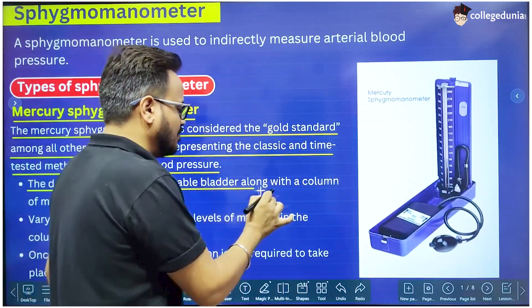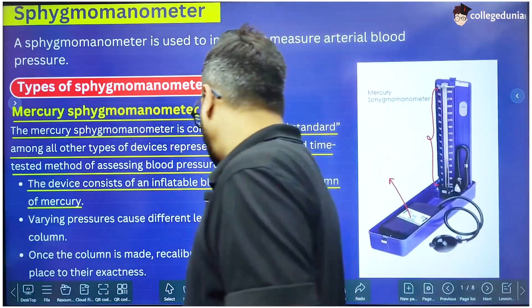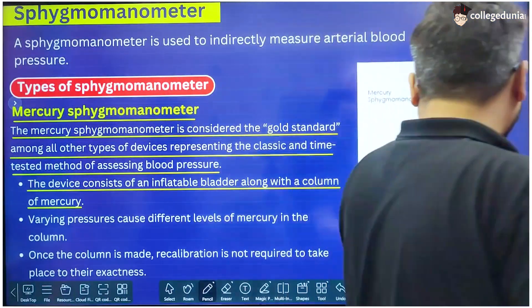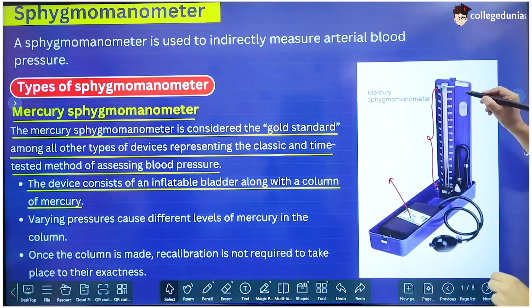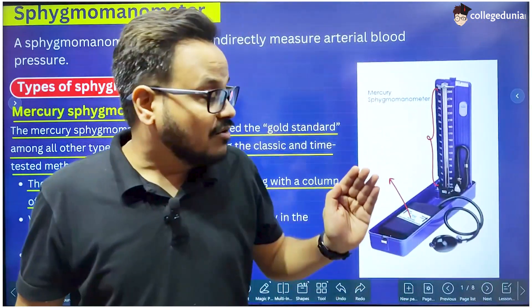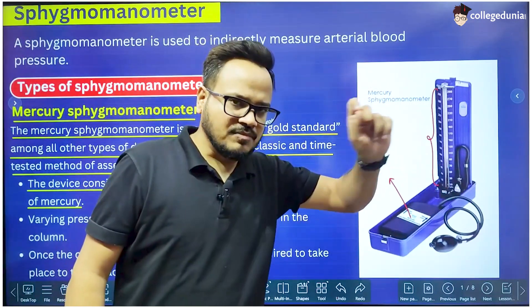The device consists of an inflatable bladder along with a column of mercury. This is the inflatable bladder and this is the column of mercury. The varying pressure causes different levels of mercury in the column. If you connect this cuff to the arm of a patient, by changing the pressure in the cuff you can see the mercury go up and down in this column. Using the markings on the column, we read the height of the mercury, and that height gives us the pressure.